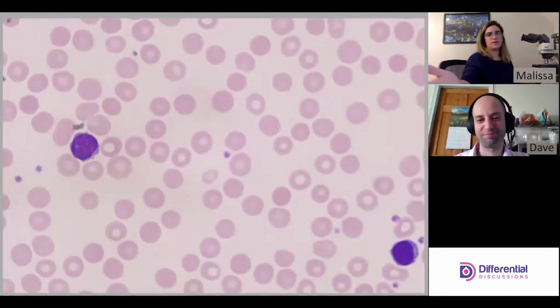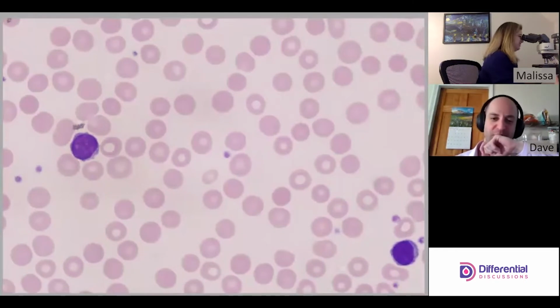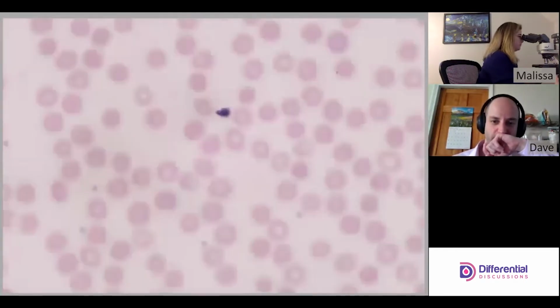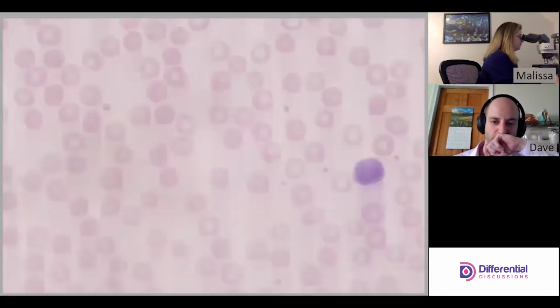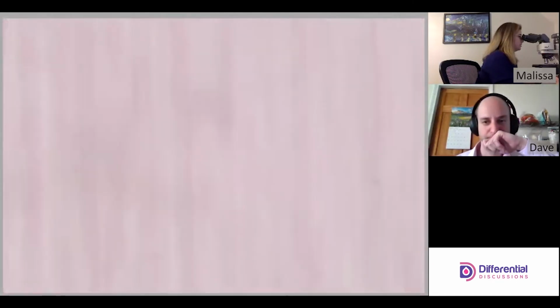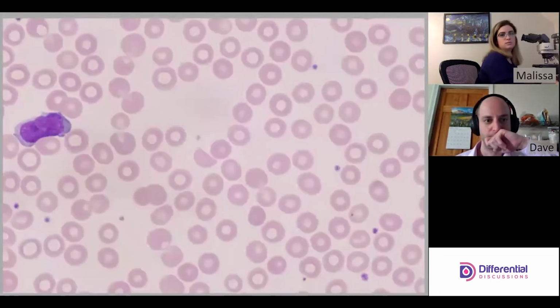Oh, these are 2 lymphs, by the way. We just ignored them. 2 lymphs. Lymph. So we said in the beginning that this slide is a normal slide.